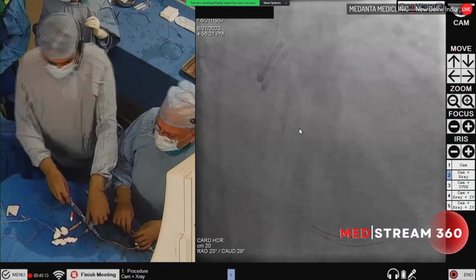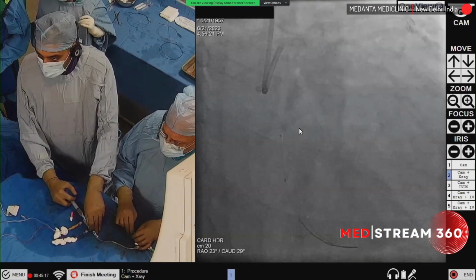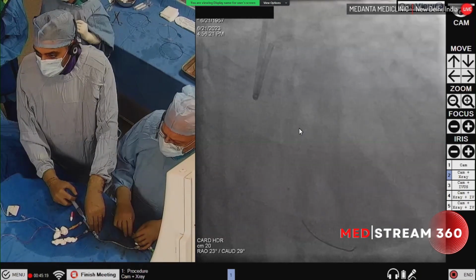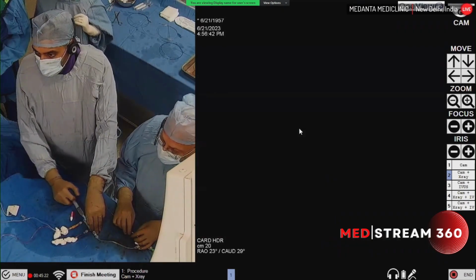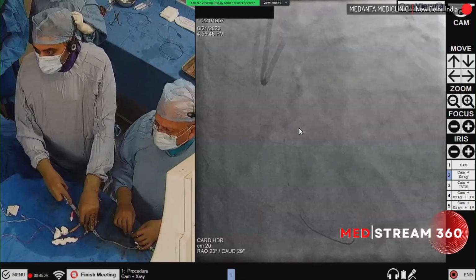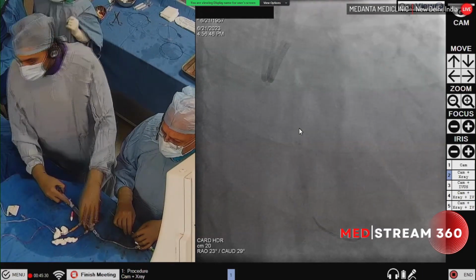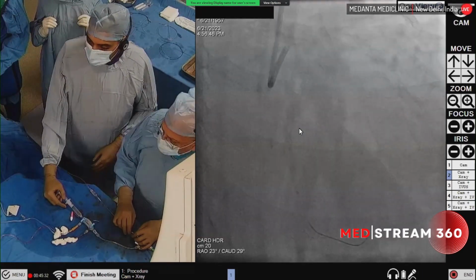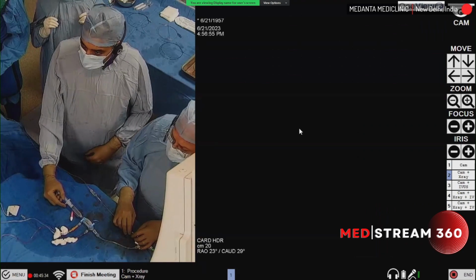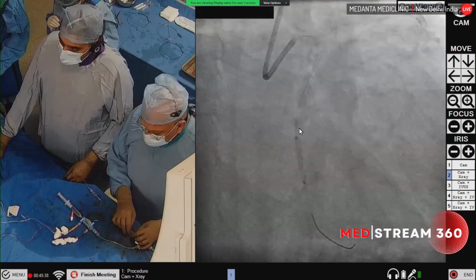Check, please. Okay, so it is going gradually. Okay, go up. 1, 2, 3, 4, 5, 6. Okay, so I won't go to high pressures here. Yes. So it has given up at 6. Very nice.